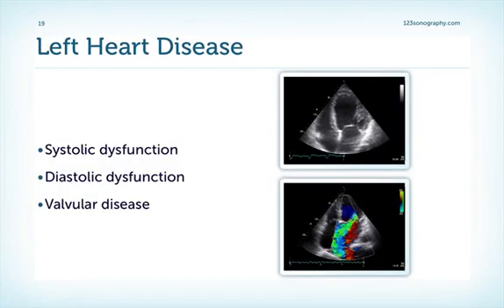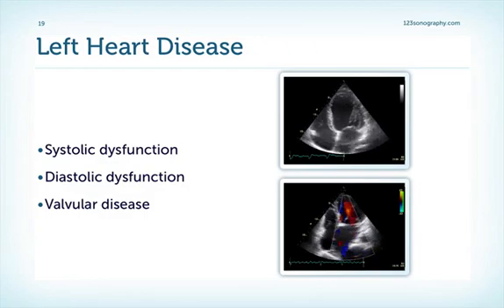The prevalence of pulmonary hypertension in patients with chronic heart failure increases with the progression of functional class impairment. Up to 60 to 70% of patients with severely reduced left ventricular function, as you can see in this patient, or in isolated diastolic dysfunction, may present with pulmonary hypertension.